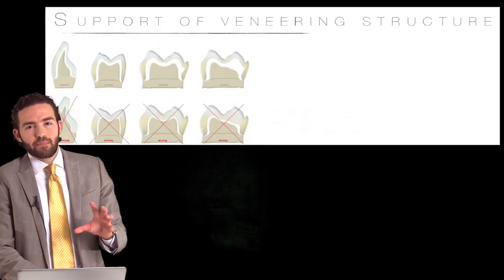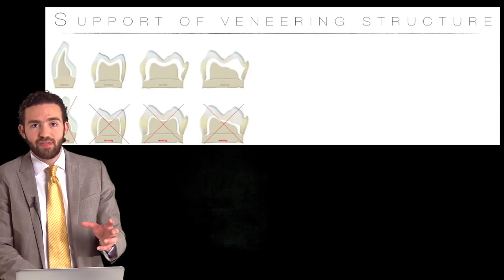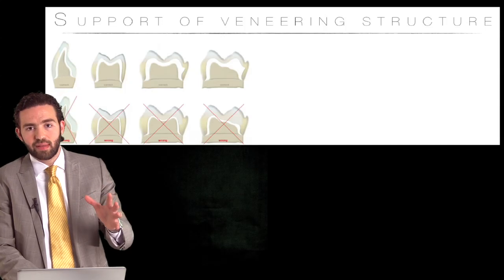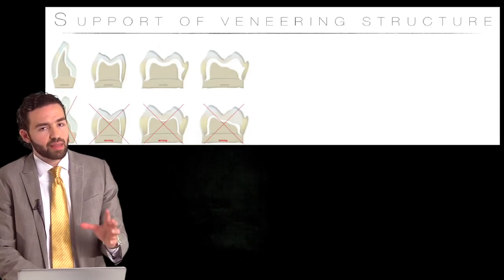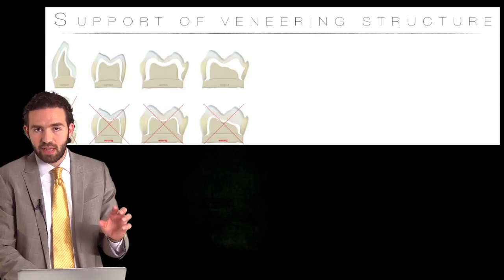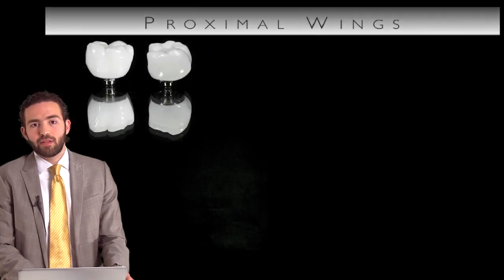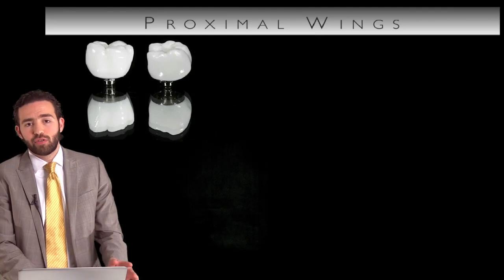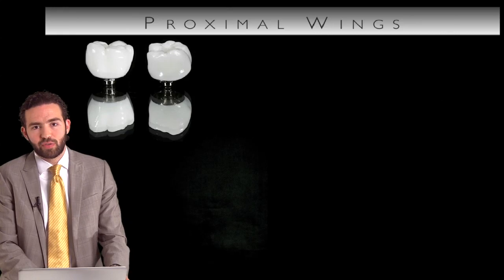So that gives us an idea that really the support for the feldspathic restoration or for the feldspathic veneering structure is very important. And there's nothing magical about zirconia. We have to apply the same principles as porcelain fused to metal in terms of support. So we try to come up with some solutions to maybe reduce the amount of chipping of those restorations.